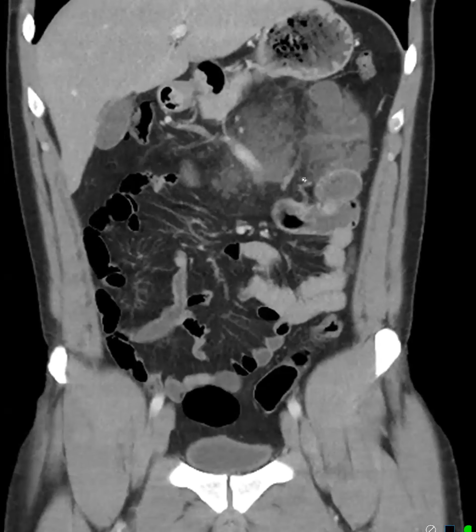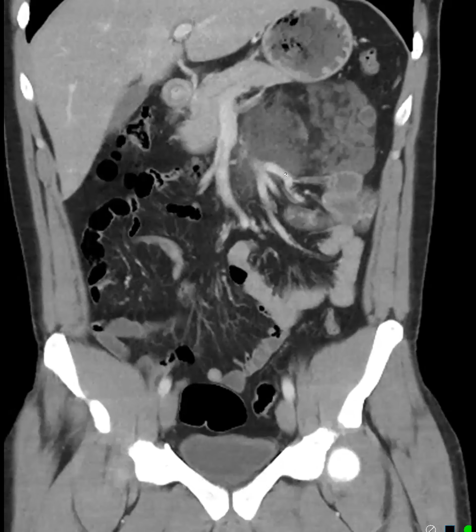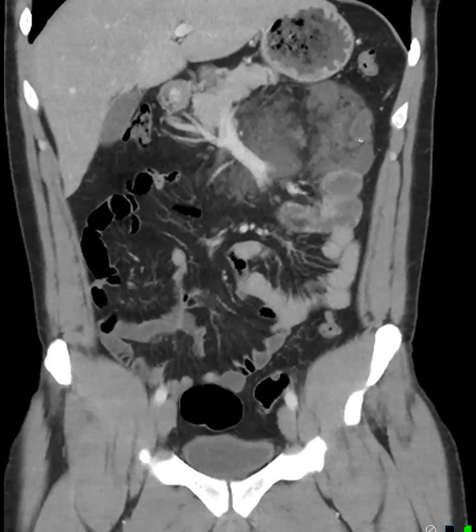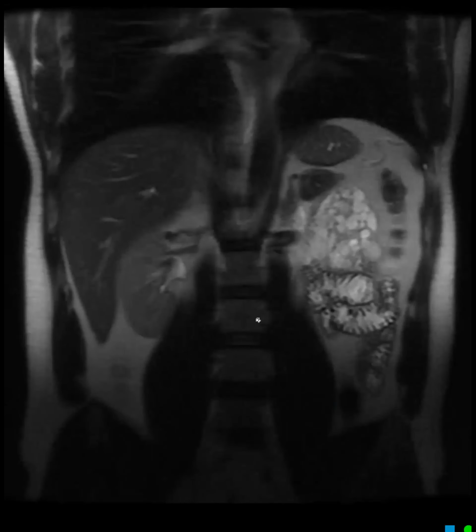Yeah, so I think we looked at a similar case a few months ago. As a resident, we do not see this kind of case frequently. When we see these mesenteric lesions, we initially think of maybe lymphoma, or all those non-specific entities like mesenteric panniculitis or sclerosing mesenteritis. But here, especially the lateral portion looks kind of cystic. And when we measured the Hounsfield units, it was fluid density. But just to confirm, we got an MRI.